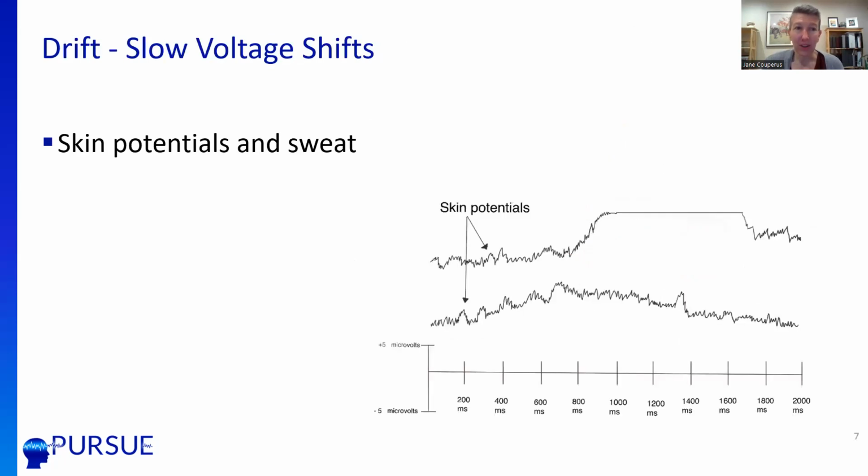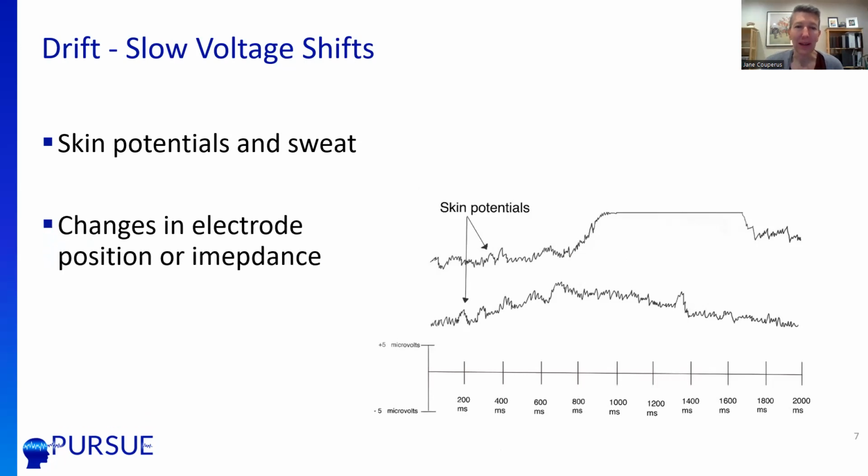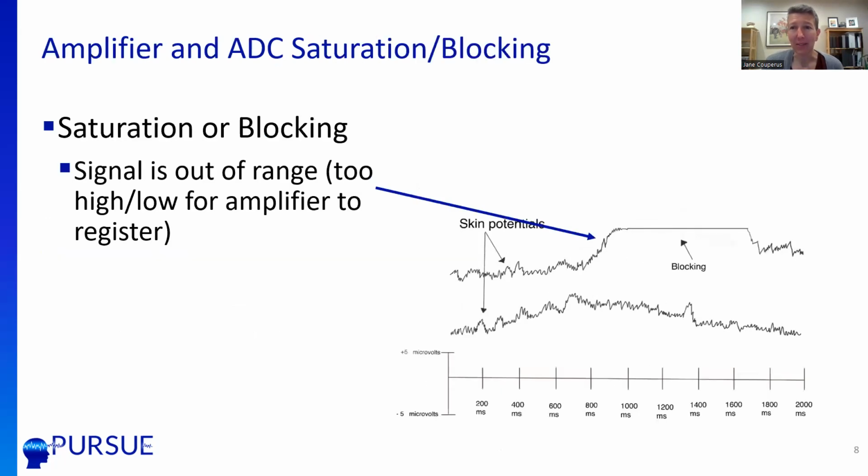You can also have slow drift, skin potentials and sweat. When you get hot, it actually impacts the impedance you have, and it will change your data, and there'll be some slow drift. And so that can be something that you care about because it will drift out of range or drift just enough that from trial to trial it's different. It can be due to the subject moving around or your electrolytes drying out, many different reasons.